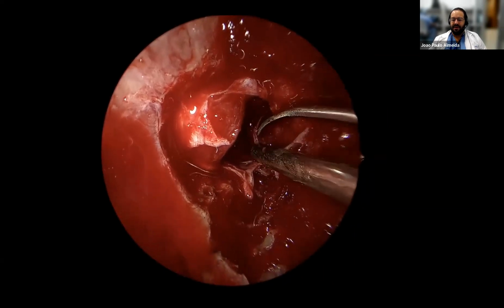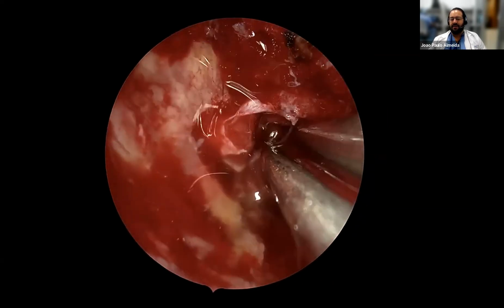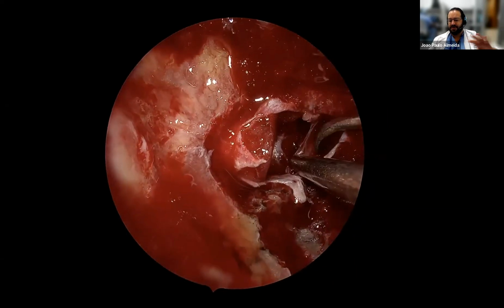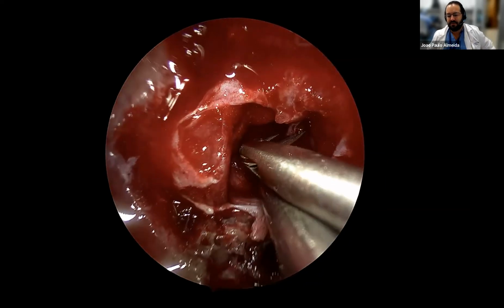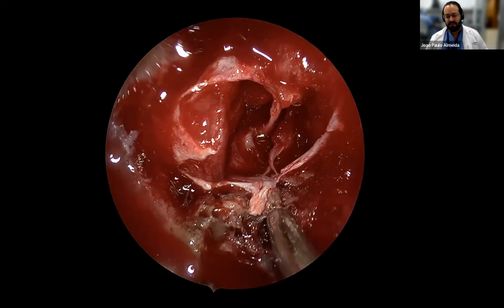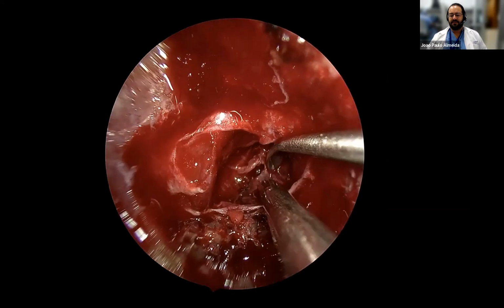And then I continue to do dissection with a straight dissector. We can irrigate and make sure to create that plane of separation, and then you continue pushing. You just mobilize that wall from lateral to medial, away from the carotid. There are some ligaments that will connect that wall. After those are cut, you can go and transect the medial wall, the superior aspect that you see there, and then the inferior aspect.